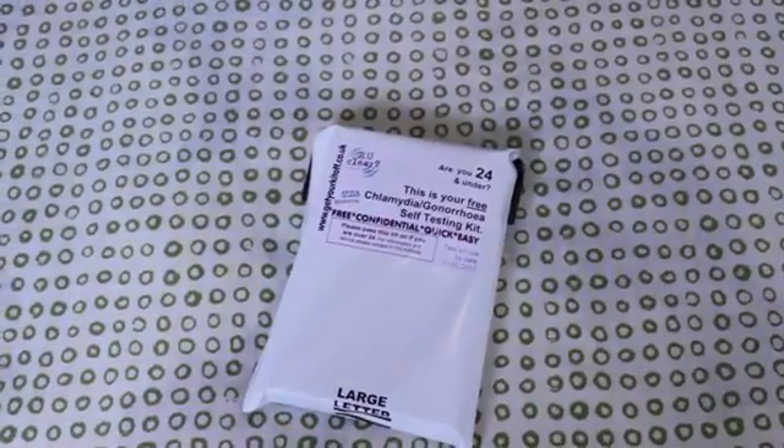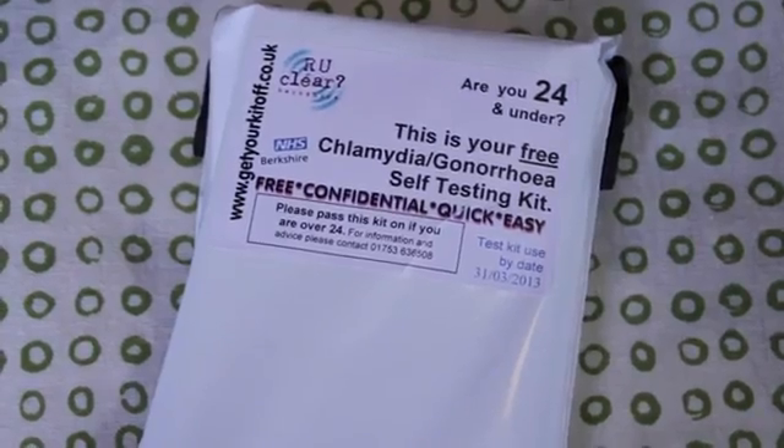However, to test yourself for Chlamydia and Gonorrhea, all you need is a test kit. And this is what it looks like. As you can see, it's free, confidential, quick and easy.